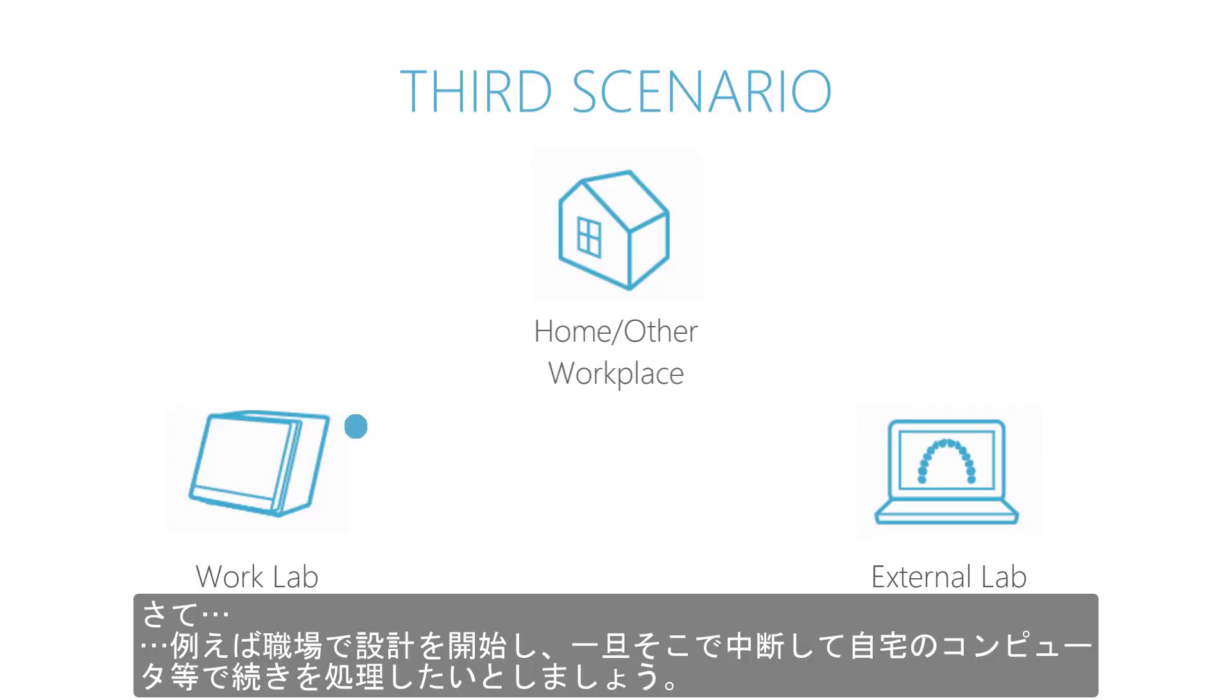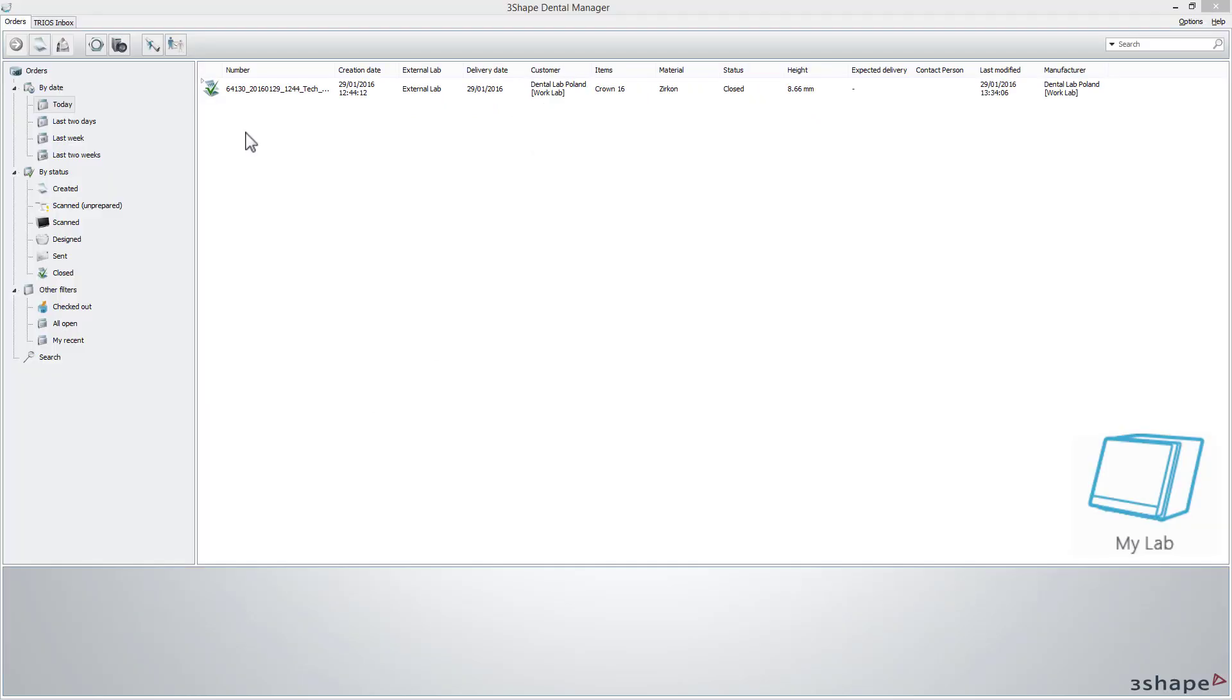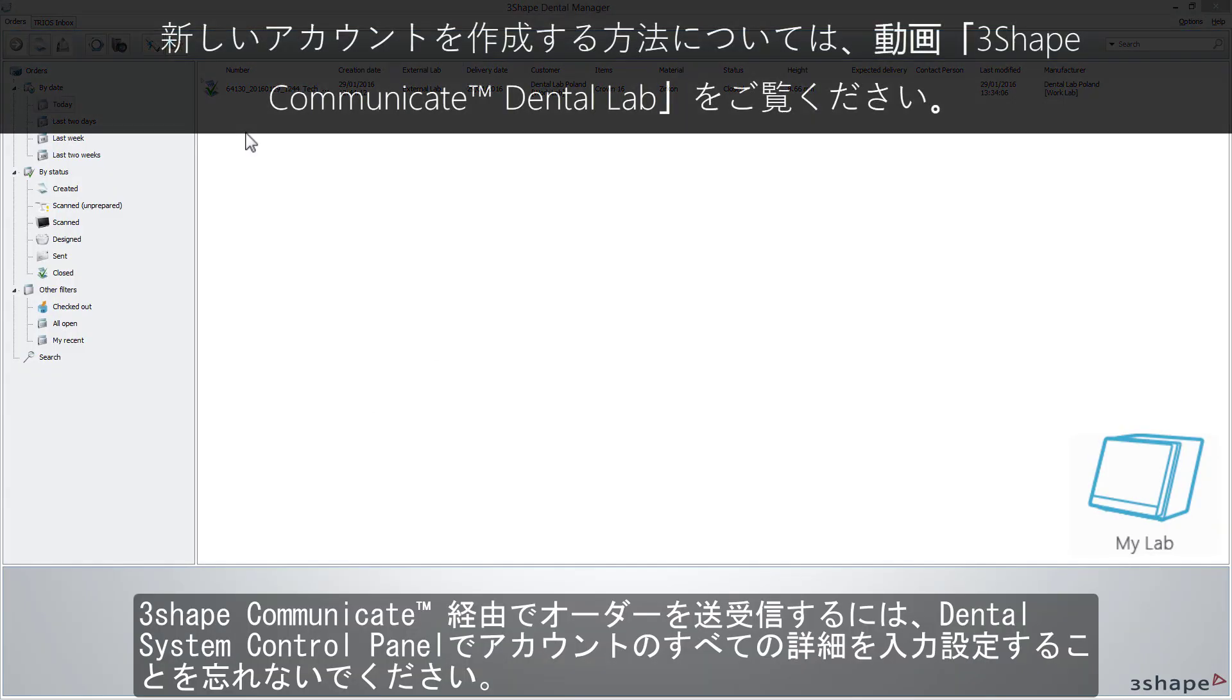Now imagine that you wish to start doing the design at work, then skip it and simply send it to your home PC or other workplace, where you can proceed with further design steps, add some changes to a previously designed order, and eventually easily save a completed design.